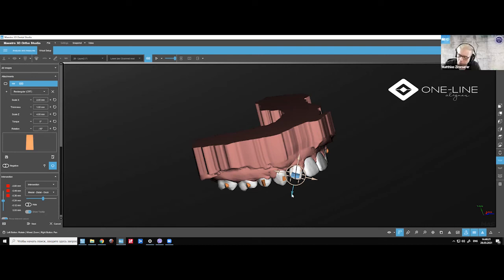How about a combination of negative attachments and such an attachment like this? Sorry, Matthew, again. Negative attachments and normal in combination on one tooth. You think, for example, on the buccal side a negative attachment and on the palatal or lingual side a normal attachment? Yes, of course you can do it. You can do it on both sides. If you want to press from here and press from here, you can do it from both sides. Okay. Cool.